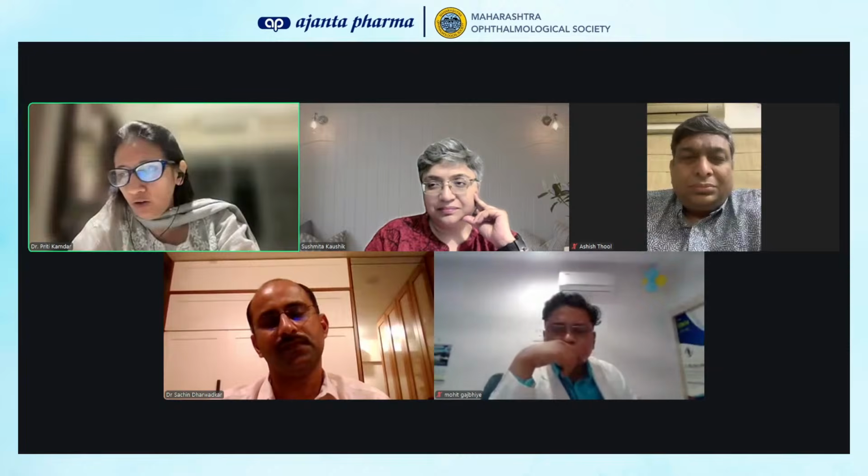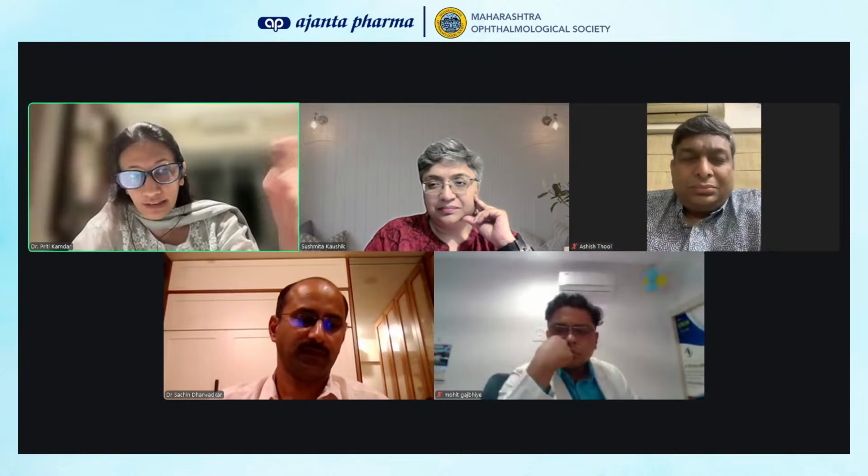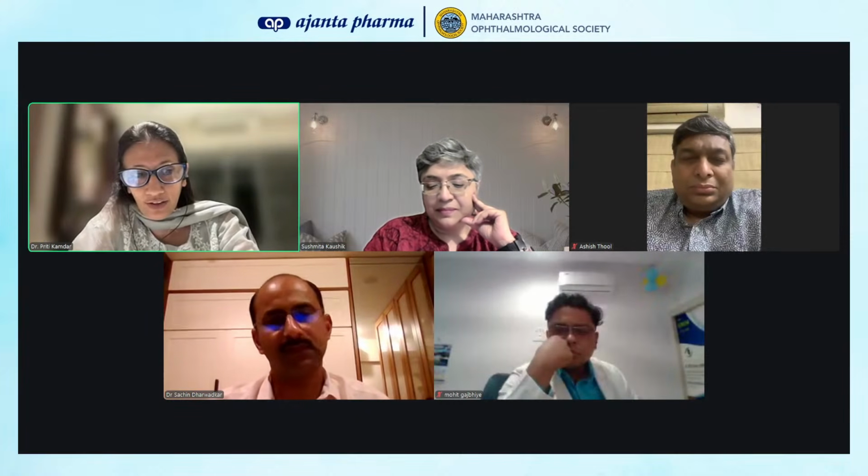Okay. So am I safe in saying that yes, if you have diagnosed glaucoma, then trifocals is a no, because you don't know how it's going to progress. But if it's a suspect, say ocular hypertensive, stable with follow-up, you can probably go in with trifocals. Is that what I can tell the audience? Absolutely. I'm not sure what the OCT would be like with the trifocal.